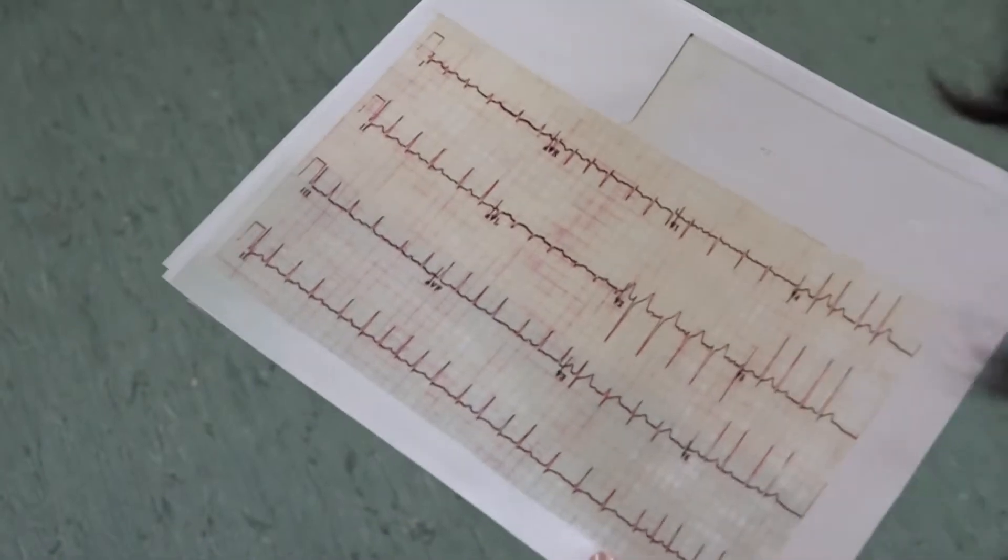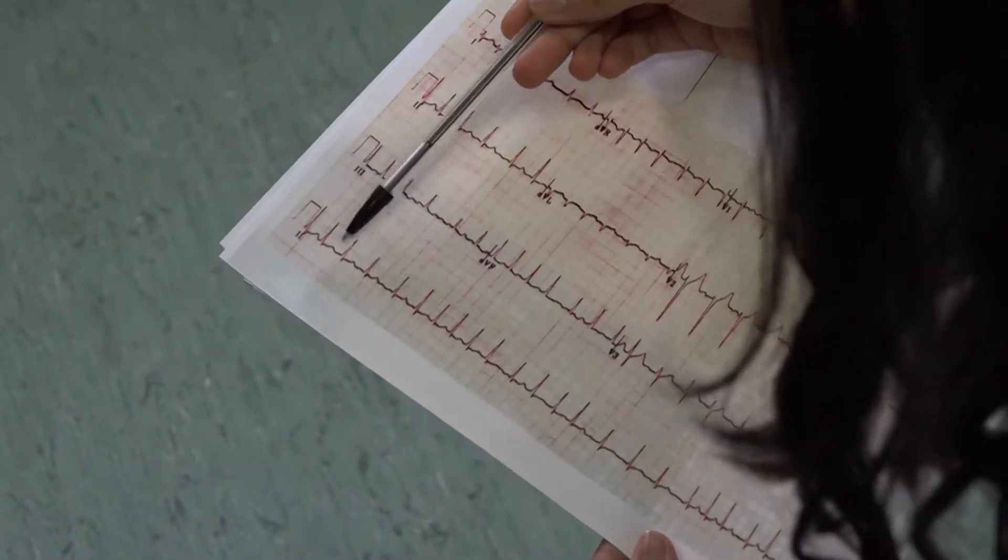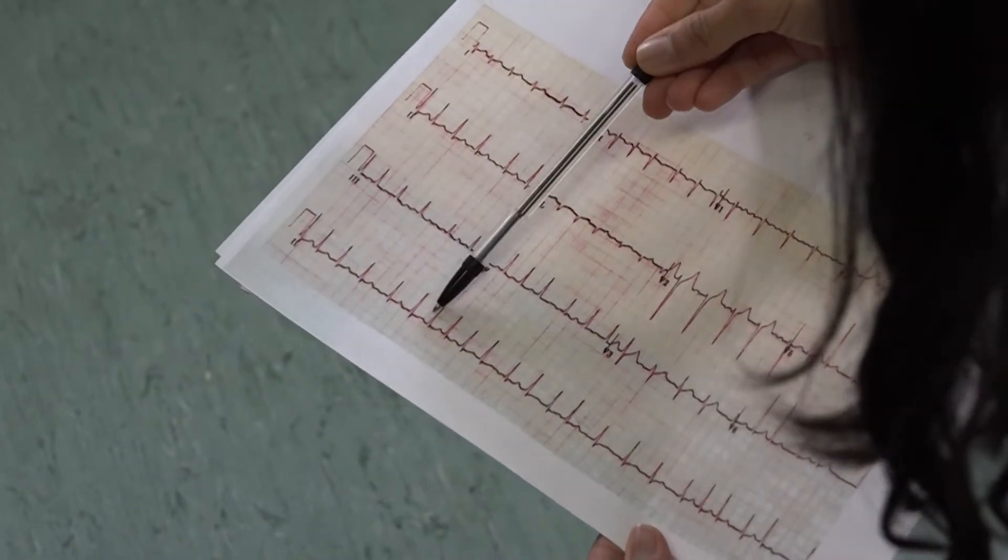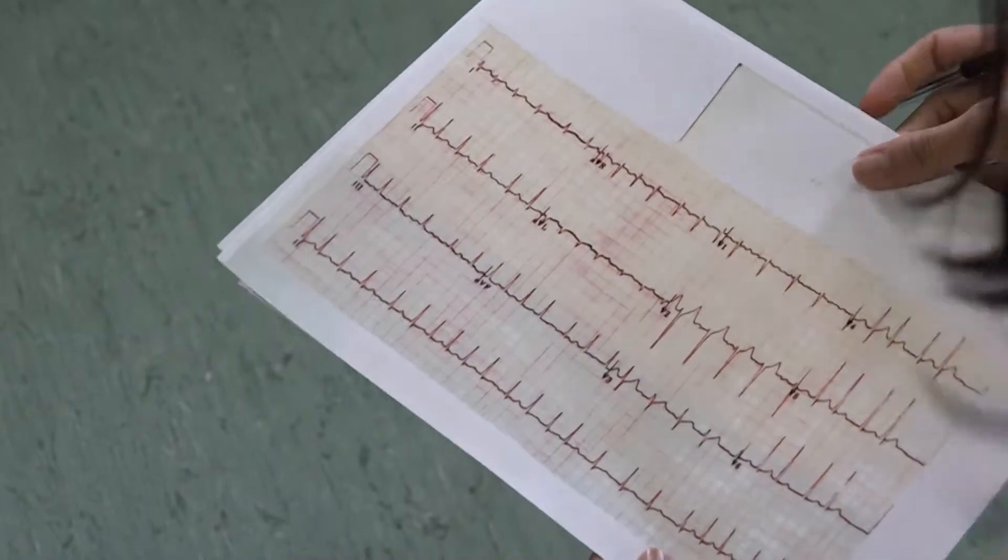This is the ECG we looked at earlier and as you can see on the rhythm strip, there are no clear P waves preceding the QRS complexes, which is suggestive of atrial fibrillation.